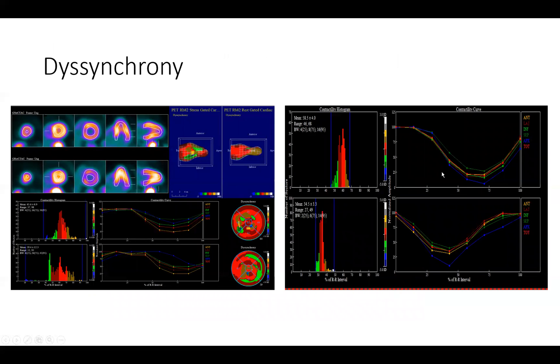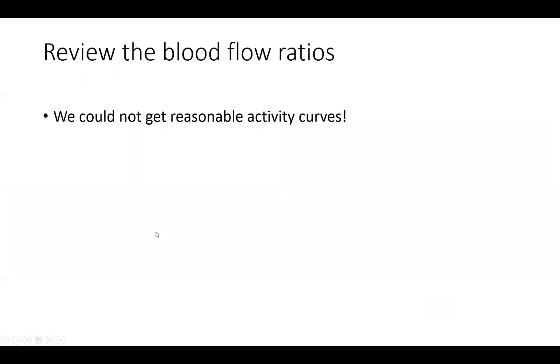We go to the synchrony analysis. In the normal patient, rest and stress show all segments contracting almost in unison, arriving at peak contractility at the same time. But in our patient you can see this scattering of contractility where no segment achieves a nice summation, resulting in significant dyssynchrony. Despite our best efforts we could not generate activity curves that are reasonable for this patient, therefore we did not report the myocardial blood flow or the flow reserves. You should not report it if the activity curves are not properly tracking the activity in the left ventricle.